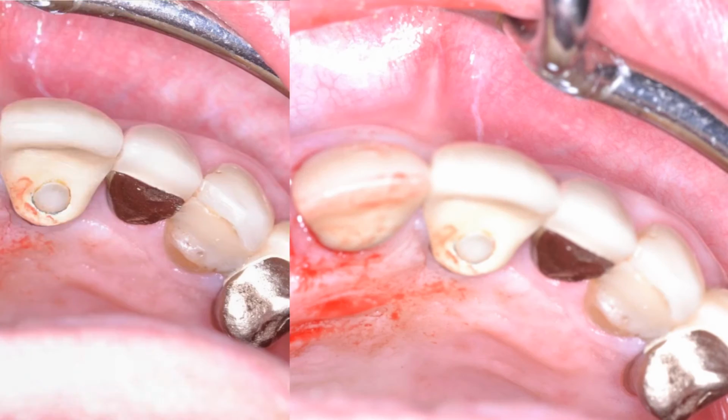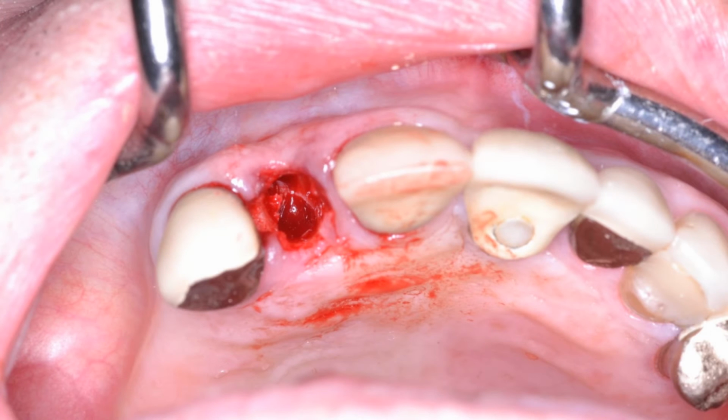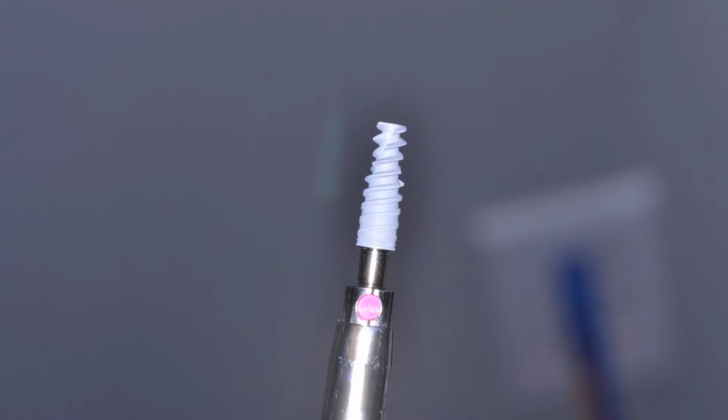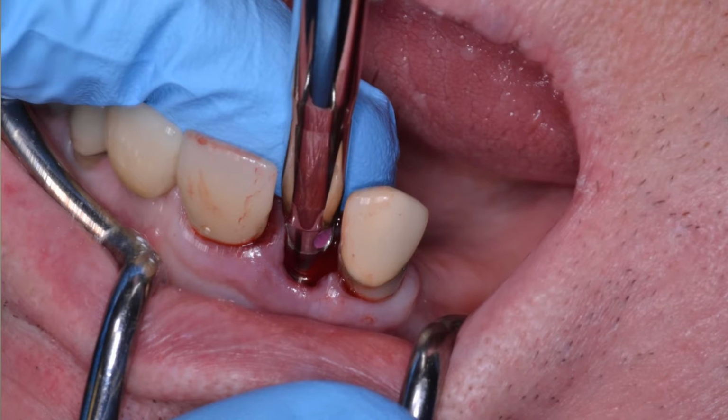So there you can see we used the precision drill to create some sort of a palatal hole, and then basically followed through with the final burr series there. Go and grab our Nobel Active implant. In this case, you can see I'm using a hand driver to start off with buccally and then move that more palatally. As you'll see here, we finish this in a palatal screw retained position.